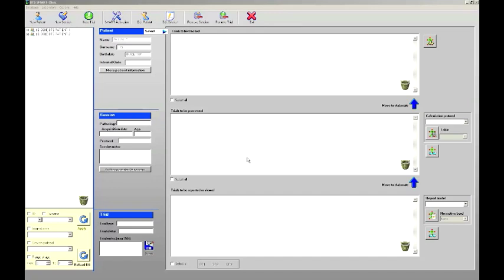After having prepared both the system and the patient, we are ready to start with the data capture. First of all, it's mandatory to insert a new patient folder into the Smart Clinic database. To do that, you can use the first button named New Patient of the toolbar.